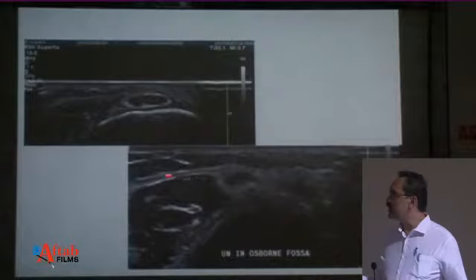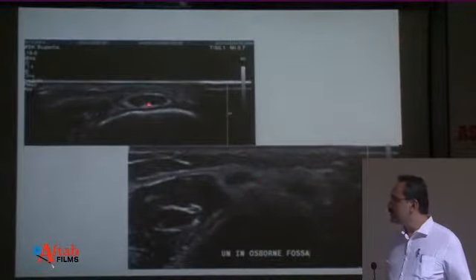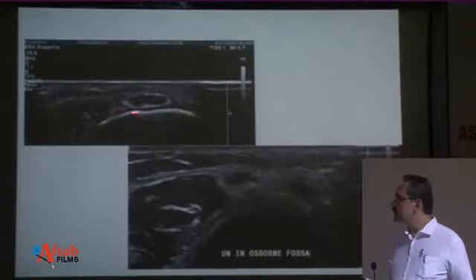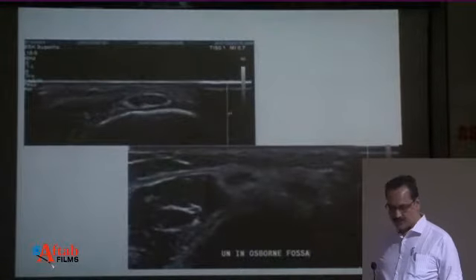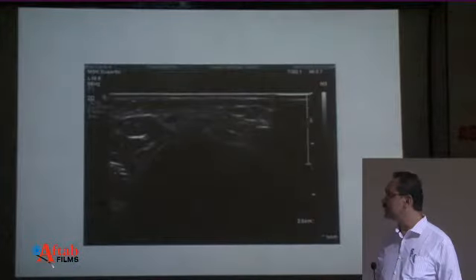There is injury to the ulnar nerve, and this is the ligament of Osborn, which is also thickened, and you can see the ulnar nerve peripherally is showing echogenicity and enlargement at the level of elbow. This was just a few days back we did this study.